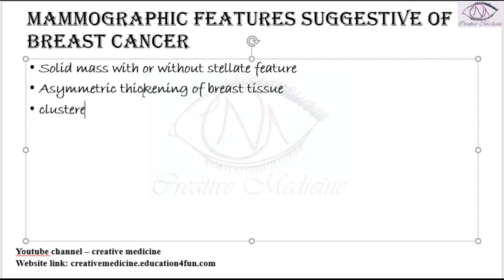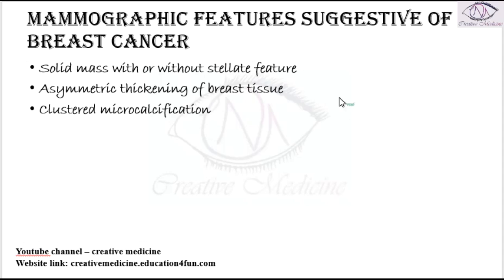Third, clustered microcalcifications are seen. So these are the mammographic features which are suggestive of breast carcinoma.